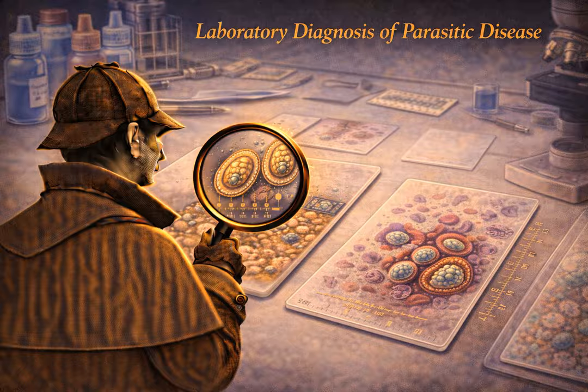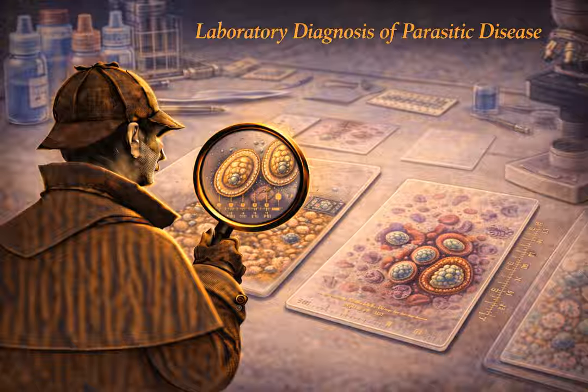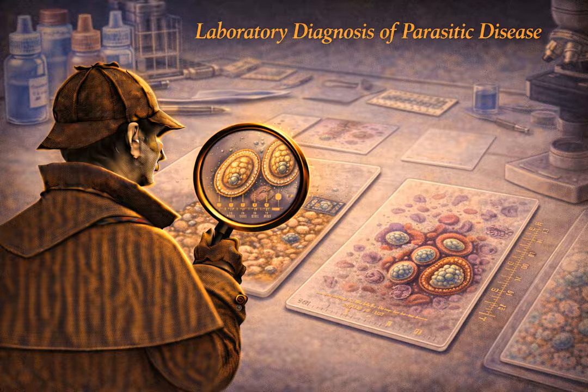Unlike Ascaris or hookworm, Strongyloides eggs hatch deep within the human intestinal mucosal wall, so the actively swimming larvae are what actually pass out in the feces. If the tech only scans for oval eggs, they will miss the infection entirely.